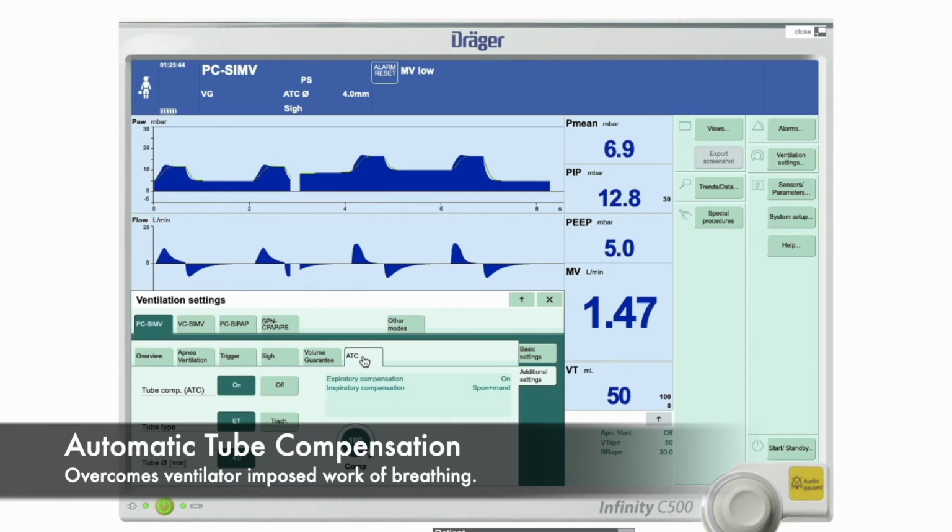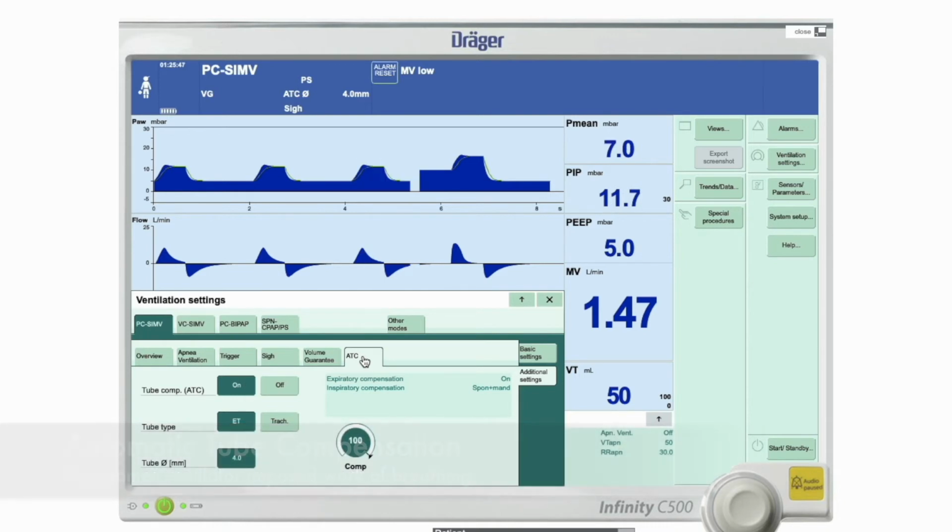Now, what is that? So the ET tube presents a problem. Well, it's wonderful in that we can actually ventilate people through it, but it's small, narrow, and long, so the diameter or radius isn't very big, so therefore it adds a significant amount of resistance to the airway. It increases airway resistance to the extent that the pressure at the beginning of the tube is higher than the pressure at the end of the tube in the trachea.